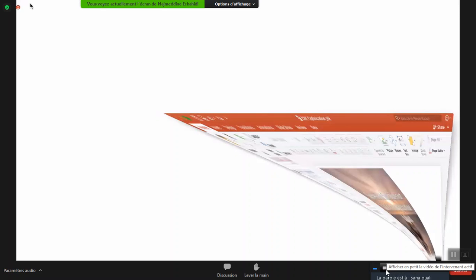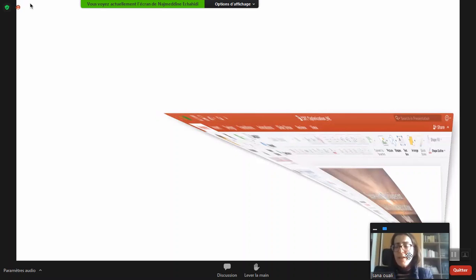For Dr. Harbia, I have a question. In my practice, I use a steerable EP catheter to catheterize the coronary sinus to reduce the time of the procedure. And I use, in one fifth of the cases, an inner catheter to do that. Do you use an EP steerable catheter to catheterize the coronary sinus?